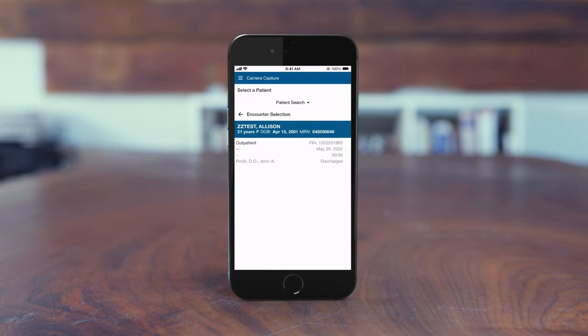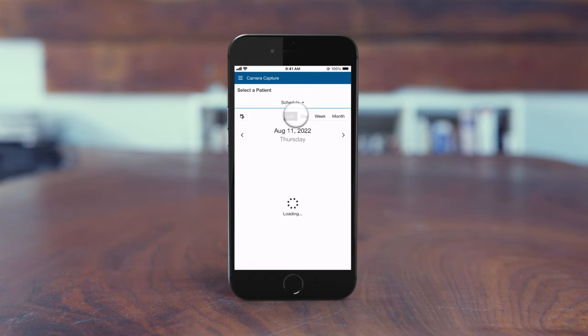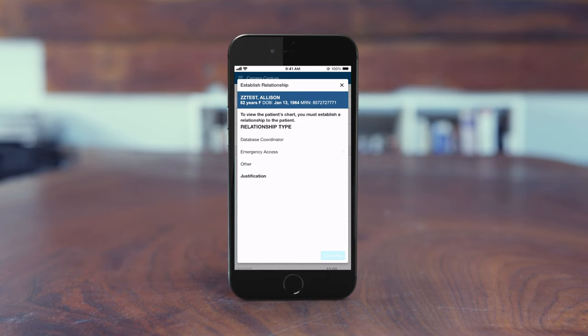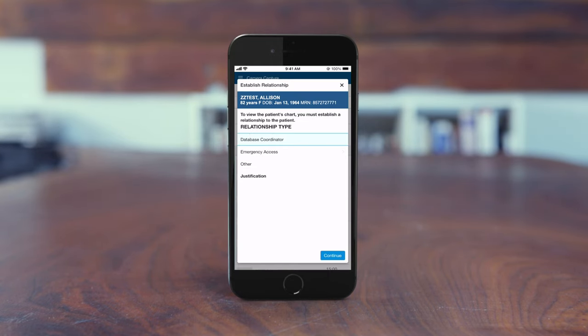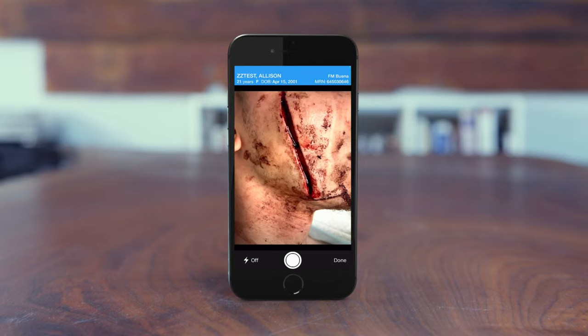Regardless of the method you choose, select a patient encounter to continue. As with other applications, you may be prompted to specify a relationship. The camera then activates.